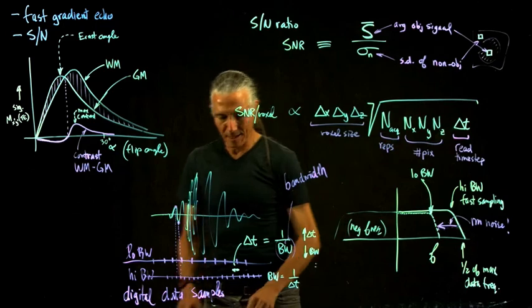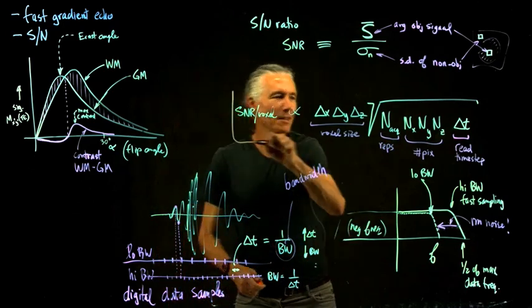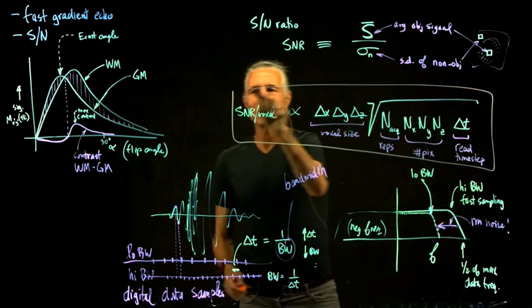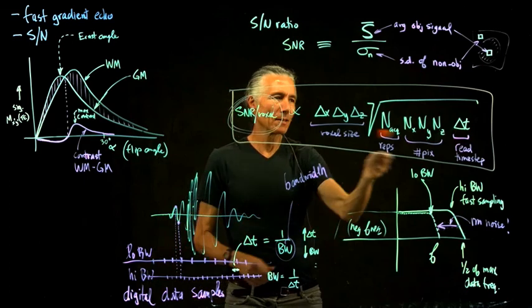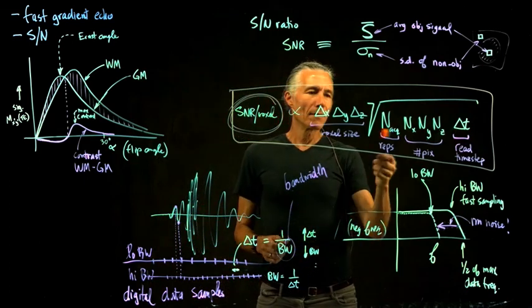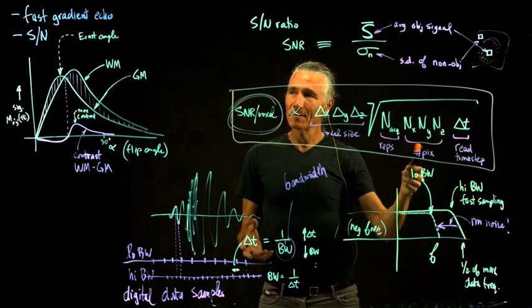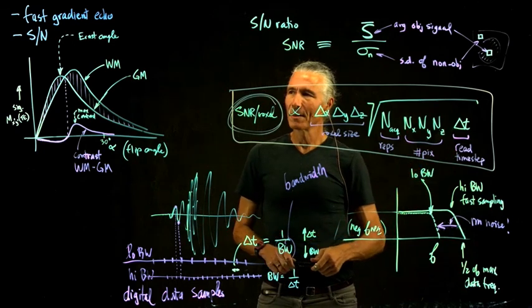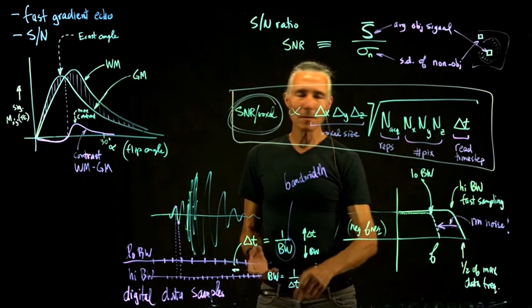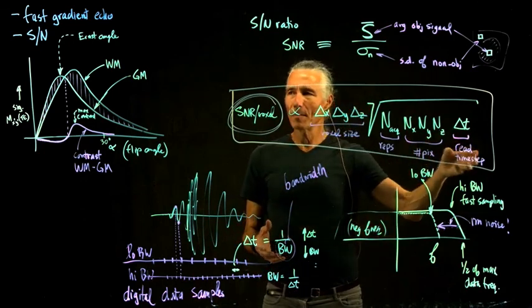But this is actually one of the few useful things I've taught you in this class. What is the actual signal to noise per voxel? How is it affected by the main things you can adjust, like voxel size, number of repetitions, how many pixels you have in your scan? That actually is a strong effect, and then what the bandwidth is. These can be varied. Sometimes if you're not in a part of the brain that's very distorted, you can go to a lower bandwidth and get more signal.